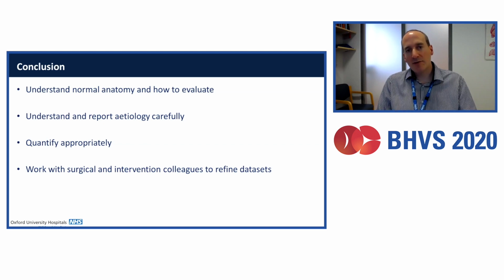I think we should quantify and we should use the tools carefully, but again, as with any echo report, make sure that all your measurements are in agreement and concordance, or if they're not, talk about why that might be. And of course, the key step is to work extremely closely with your surgical intervention colleagues to make sure that you're providing a data set that's useful to them, gives them the information they require to plan and to potentially assist and guide any following procedures.